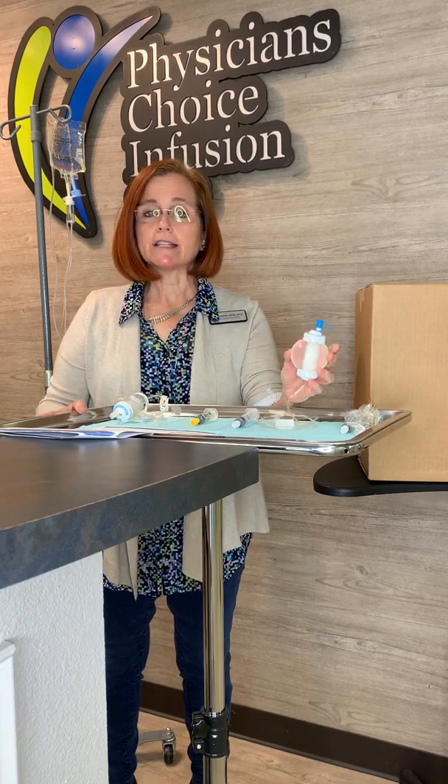Hello, I'm Beth, a nurse practitioner with Physicians Choice Infusion Clinic. Welcome. We're here today to discuss with you how to infuse your IV antibiotics at home.